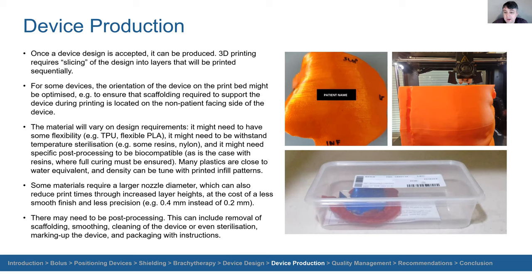The material will vary depending on design requirement. You might want some flexibility, so something like a TPU. You might want it to be able to withstand temperature sterilization, in which case you might want a resin. You might need to do some specific post-processing to be biocompatible with resins, for example.